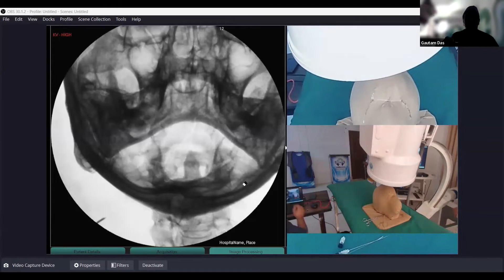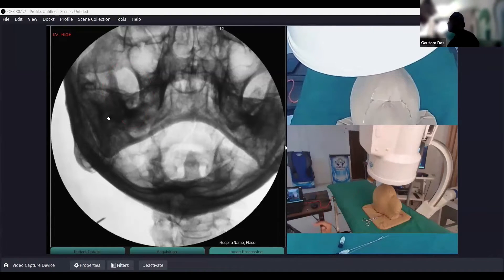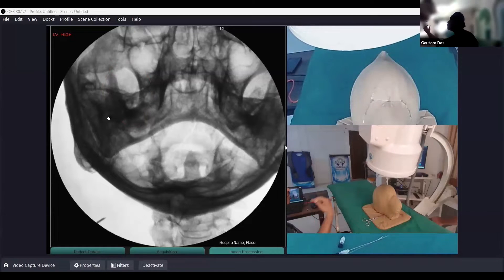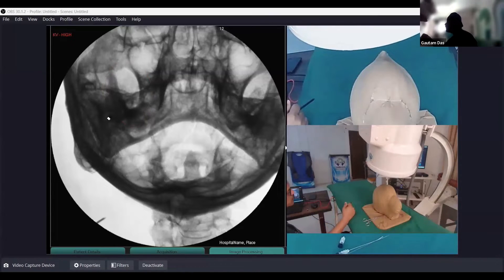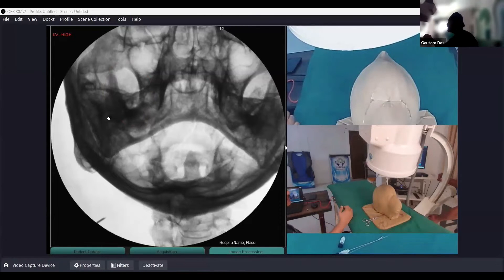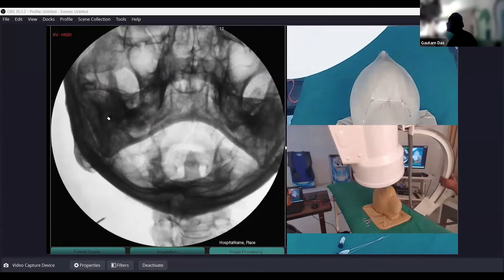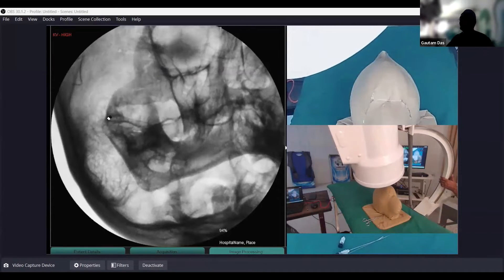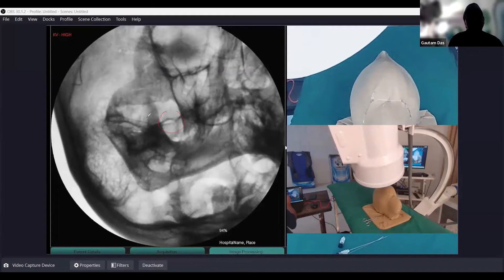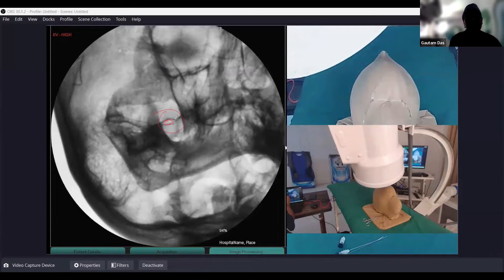At this point I cannot see the foramen ovale. If you are searching for the foramen ovale on this side, you either do the same-side ipsilateral oblique of the C-arm or rotate the head to the opposite side to find the foramen. Here I am doing the same-side ipsilateral oblique — and now you can see the foramen ovale. This is the foramen ovale; it is the largest foramen in this area.